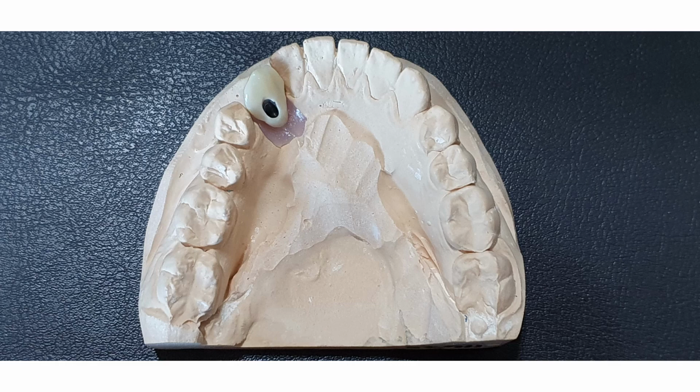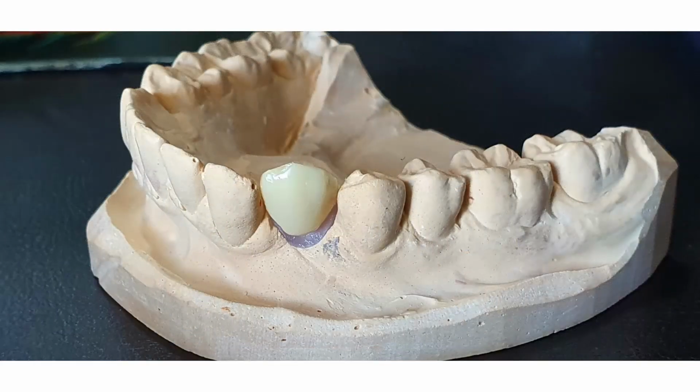Now, if the patient turns around and says, I really want to have that anthropoid space reproduced, well, that's not an issue. We can easily have enough material to actually reduce the distal if needs be and keep the same shape. Most importantly, when we come to fit this, we must check the occlusion very, very carefully.